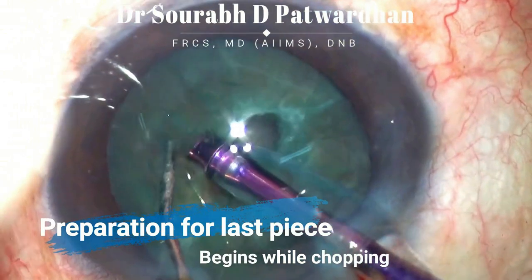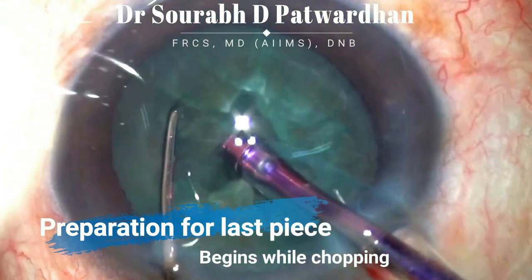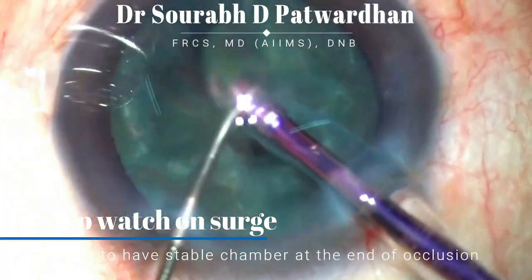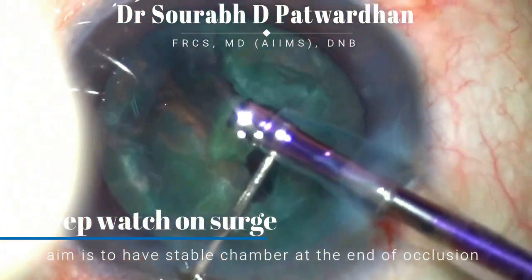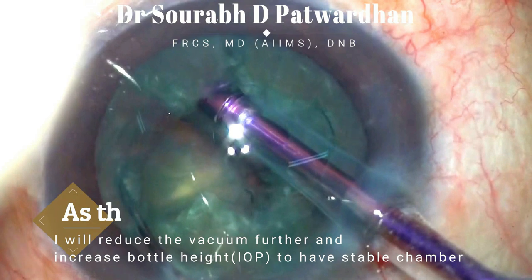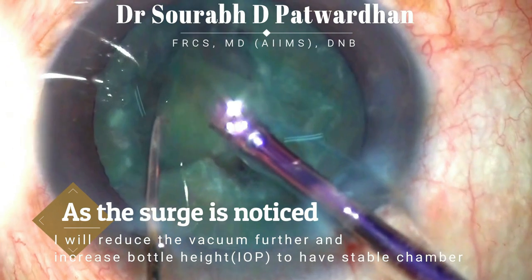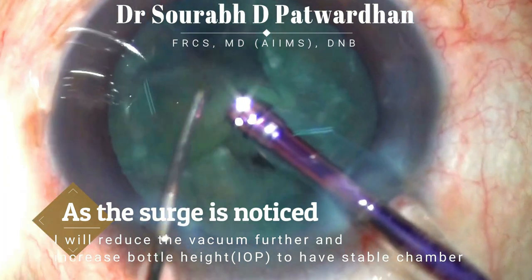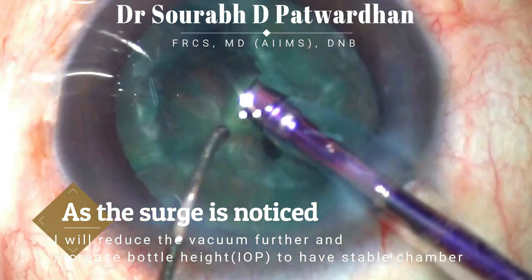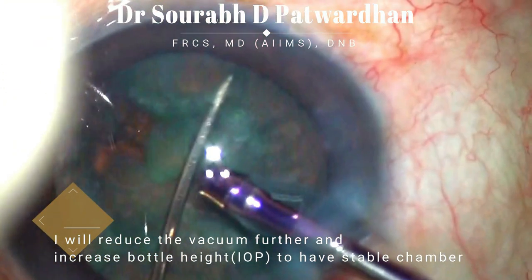The commonest time when the surgeon gets posterior capsule rupture is while emulsifying the last piece, because it is an unsupported piece. Preparation begins early — watch for surge when you start chopping or doing quadrant removal. As the surgeon tries to do the chop and then quadrant removal, you can see there is surge. Notice the pupillary constriction and fluctuation in the anterior chamber after an occlusion break, which indicates that the inflow is not sufficient to cover the vacuum being generated.